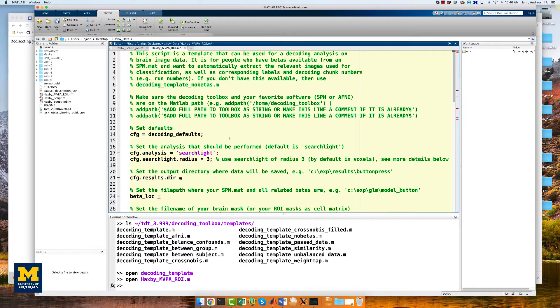On line 17, we have different analysis options to choose from. The default Searchlight will analyze all the voxels within a mask or the entire brain and determine which voxels are most useful for decoding a particular condition. We will come back to this later. For now, change the string to ROI, which will calculate the decoding accuracy across all voxels for each condition within a mask that you provide.